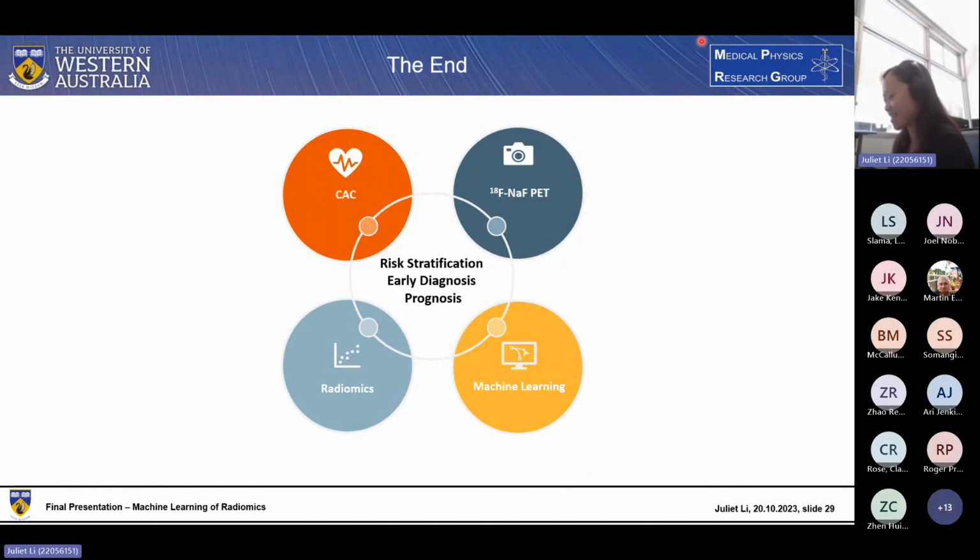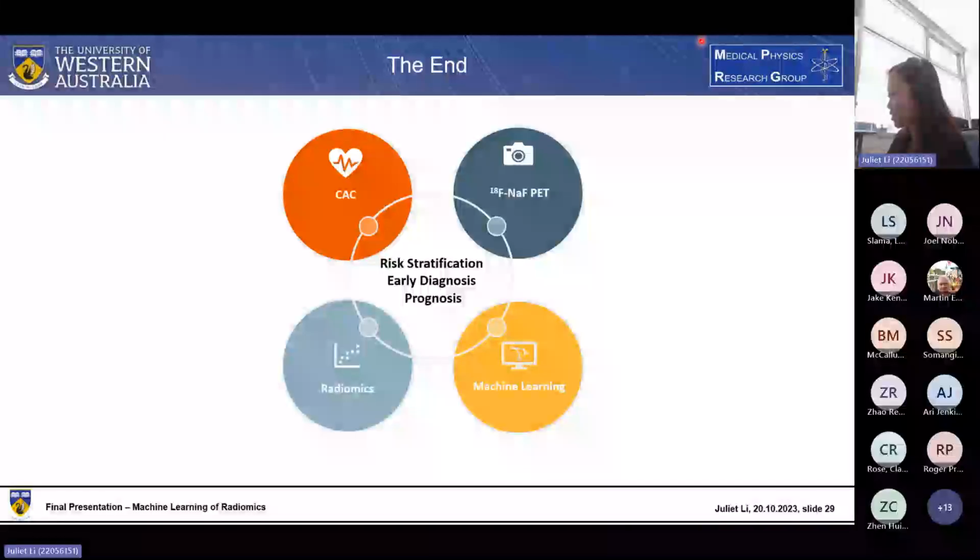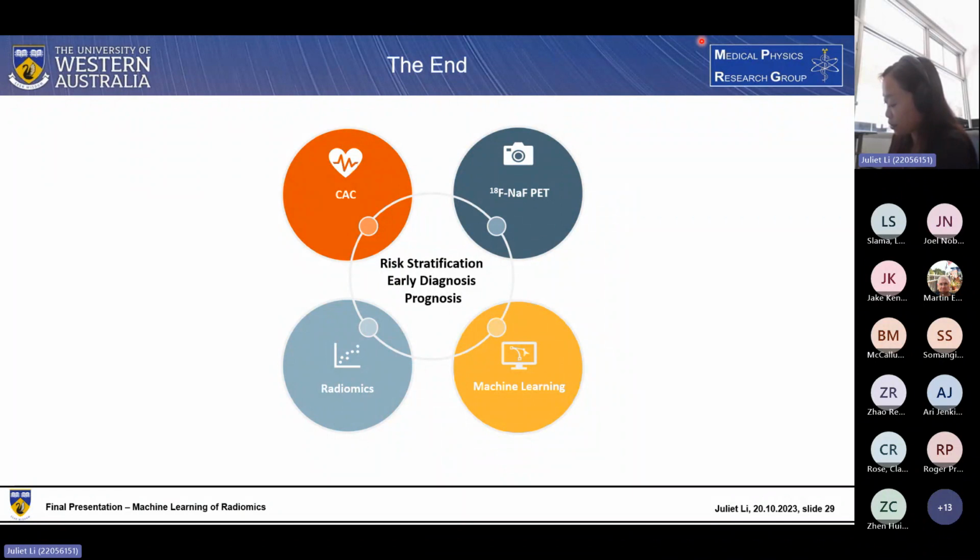I think it's a containerized AI solution within the hospital network. So it's decentralized AI, so that we'll be able to train on all of the patient data without too much of the ethics approval. Because we are implementing a containerized AI solution within the hospital network, and we're only outputting the parameters out, so it's not violating any of the ethics. So in this way, we will be able to achieve a multi-center study and train such a stabilized model with diverse patient profile.